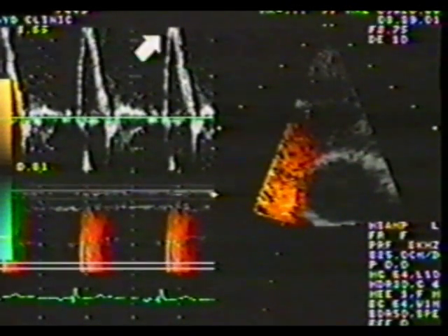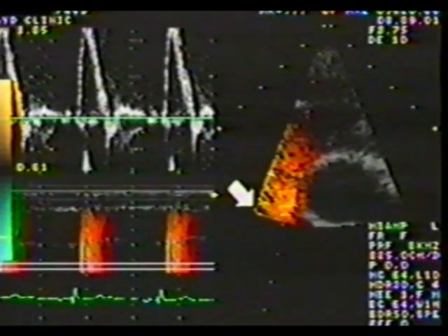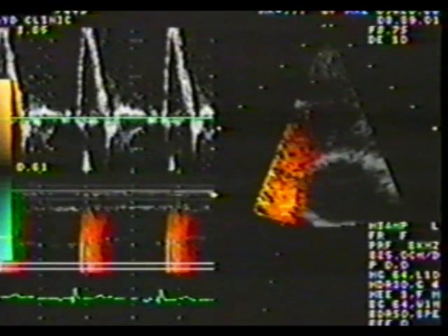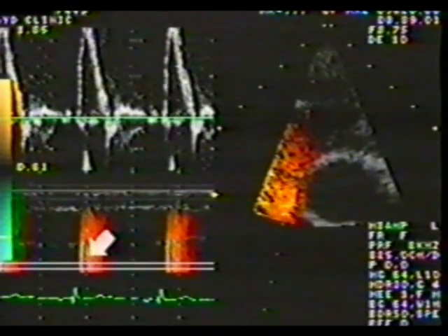The trade-off for the increase in Nyquist limit is that the depth of view has automatically decreased. However, now the ascending aortic signals are pure red on the 2D display, and on the color M mode, there is only a very small amount of blue in early systole.